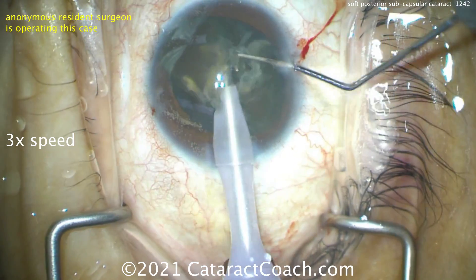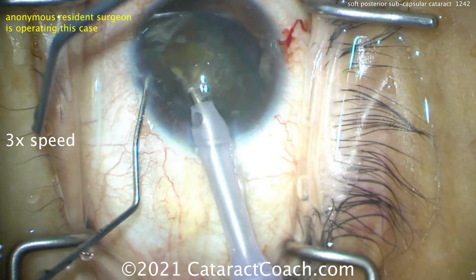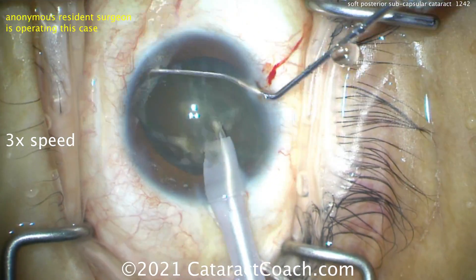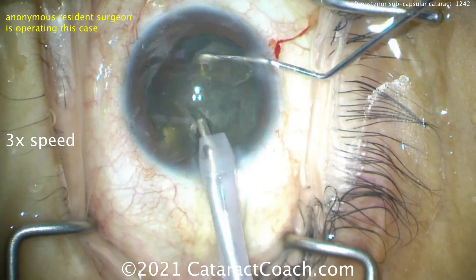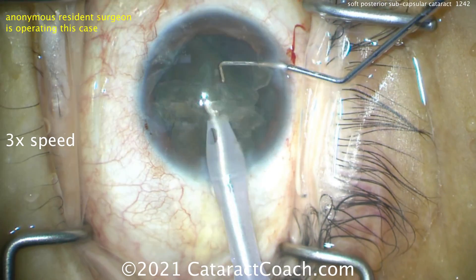The phaco probe is going in the eye and you can see there's that cataract being split apart. But the key for the whole case is get that thing up out of the capsular bag. Now the lens is up out of the capsular bag — it can be broken up into small pieces and emulsified.